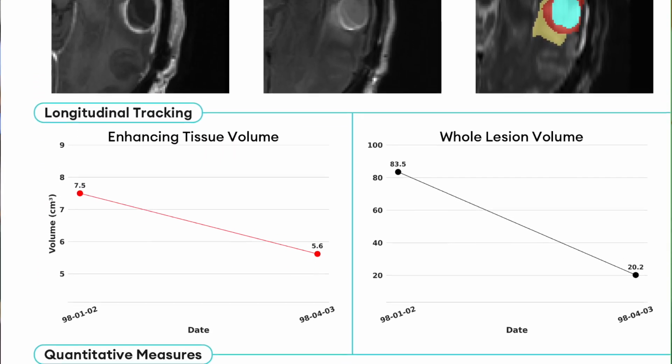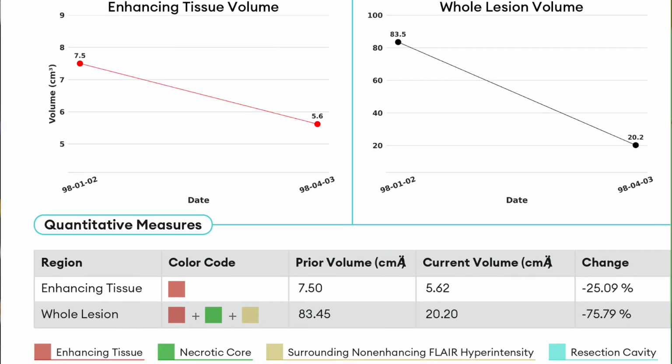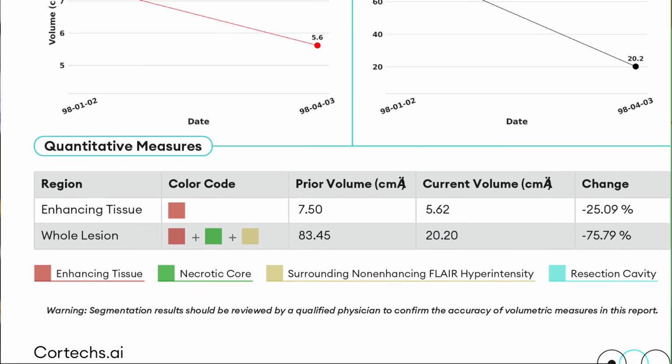It's labor intensive to measure, and the software does a better job at the volumetrics. Truthfully, volumetrics is much better than three plane measurements by us manually. What you might see as just a minimal increase volumetrically might actually be a large amount of increase. So again, very useful tool. I'm guessing you'd agree with that.